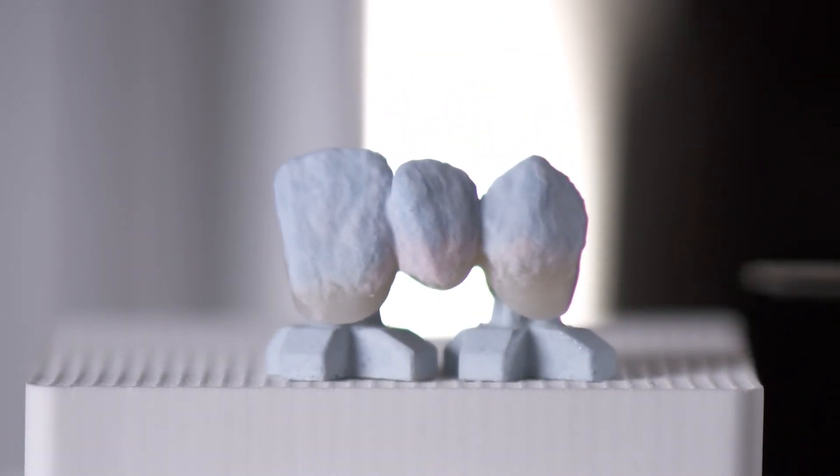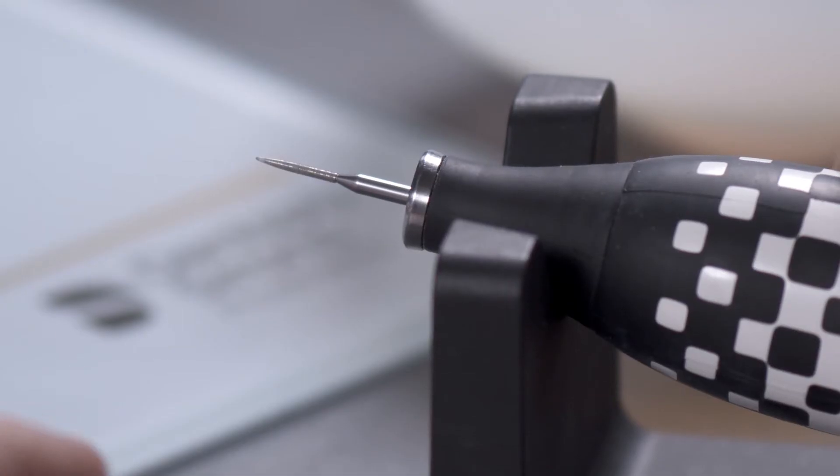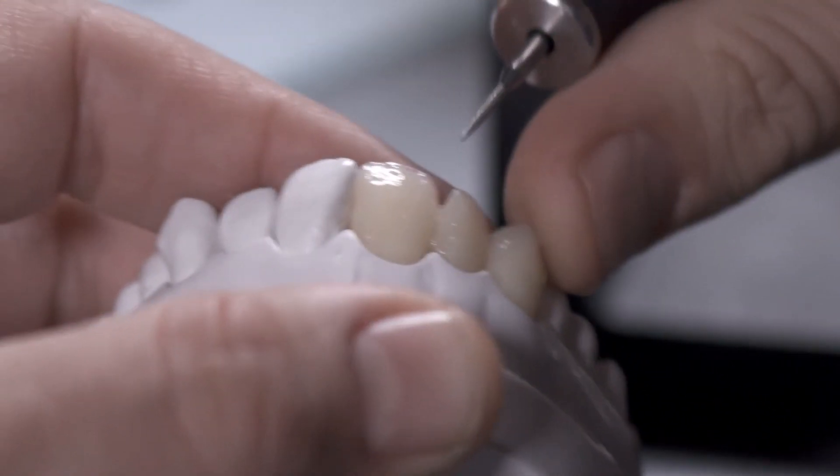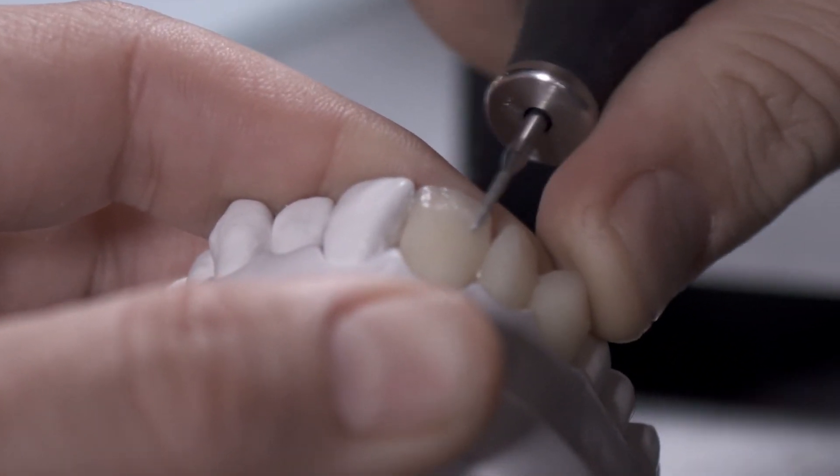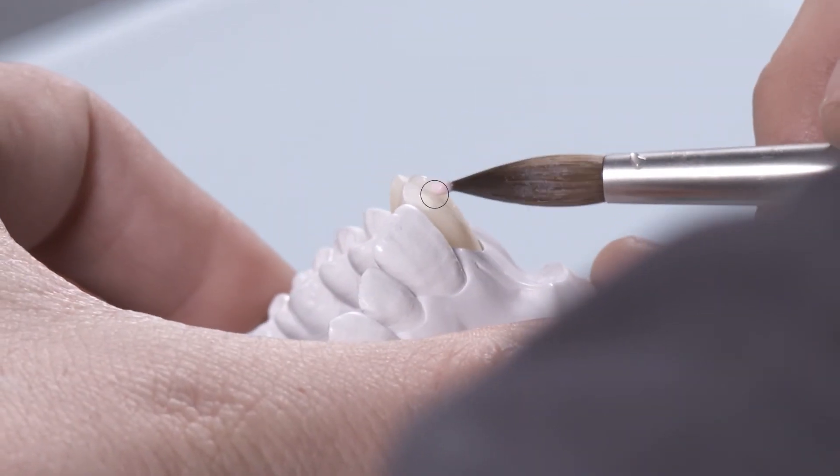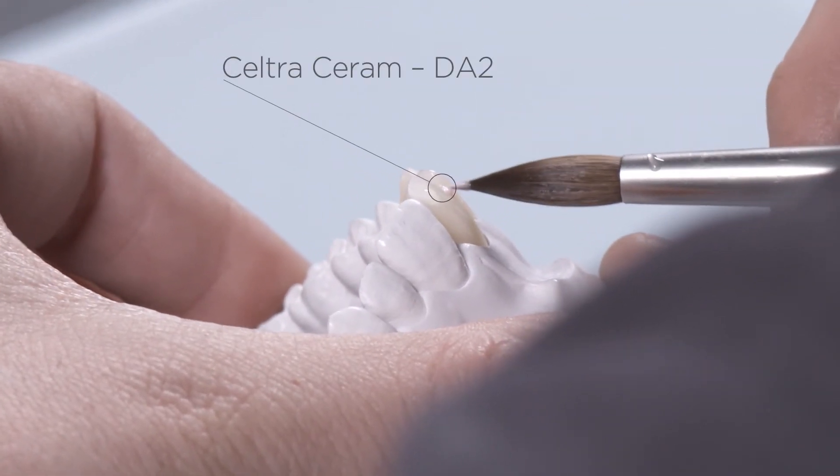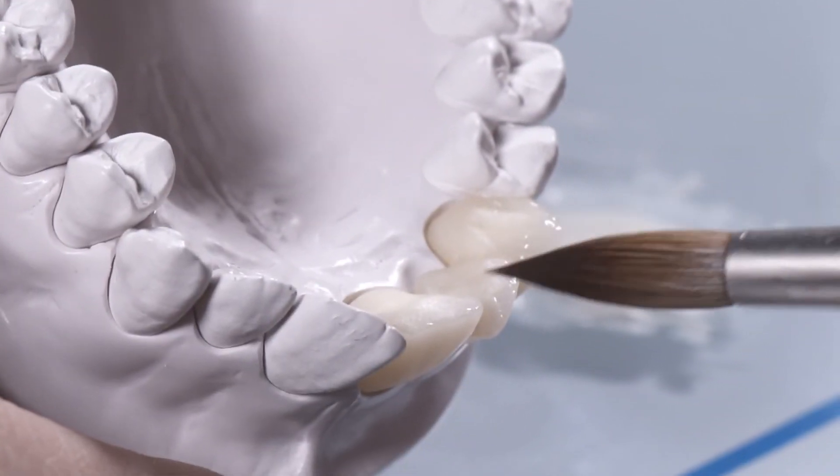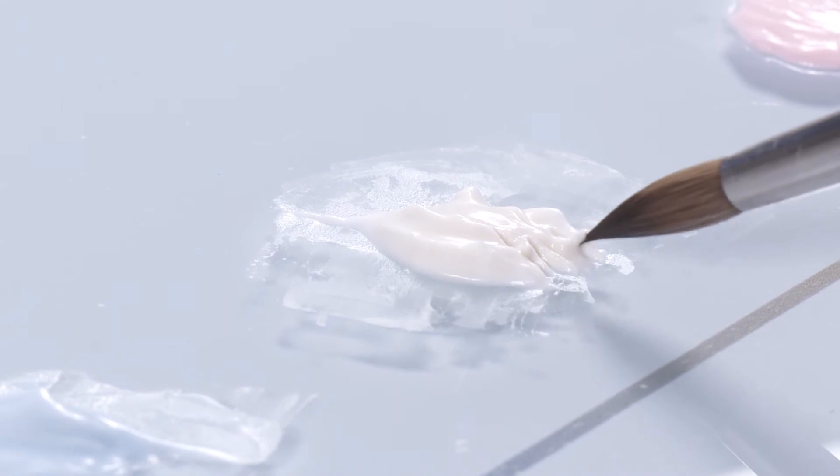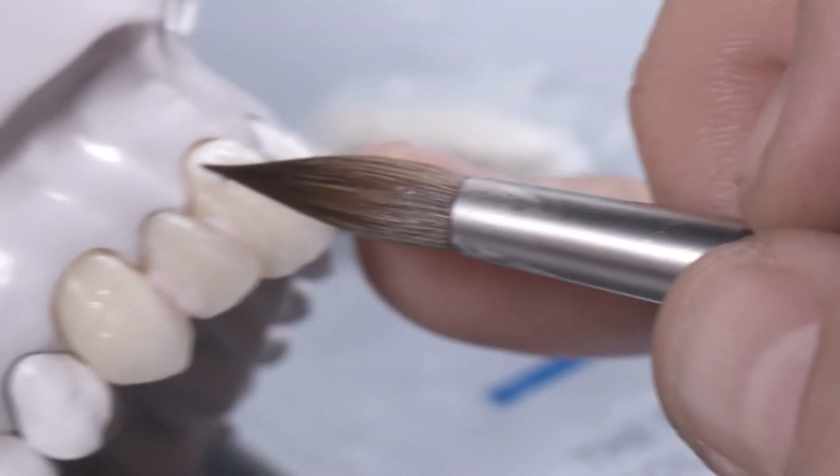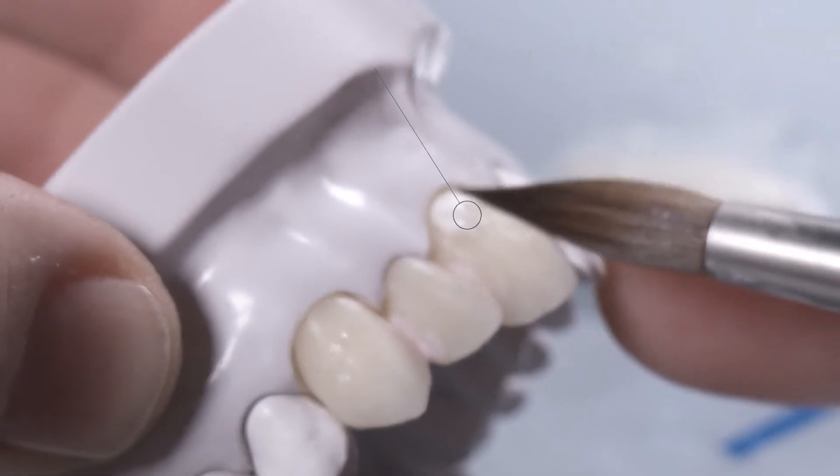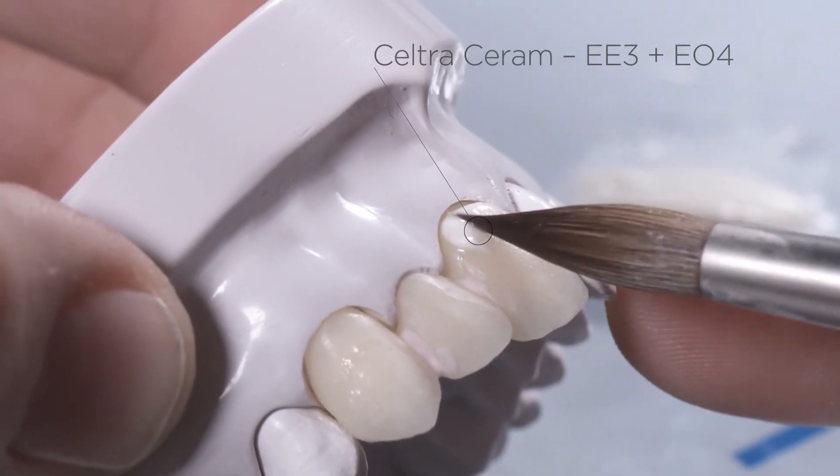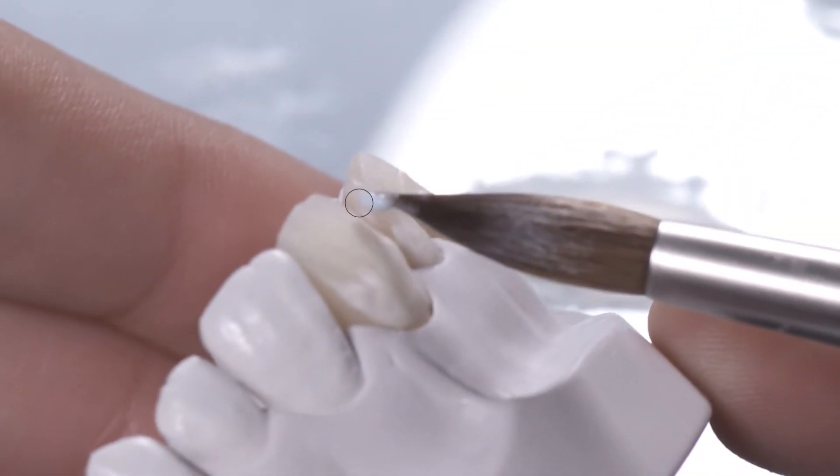After the ceramic firing, finish the shape and prepare the restoration for the second layer. Close the interdental spaces both labially and palatally with Dentin A2. On the cervical aspect, we use a mixture of Enamel Effect EE3 and Enamel Opal EO4.